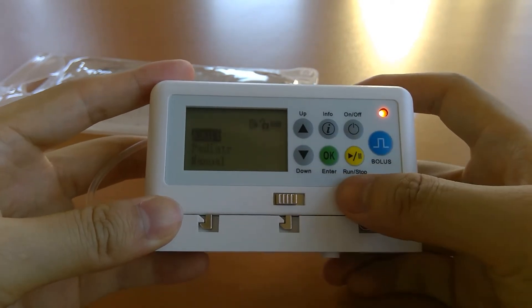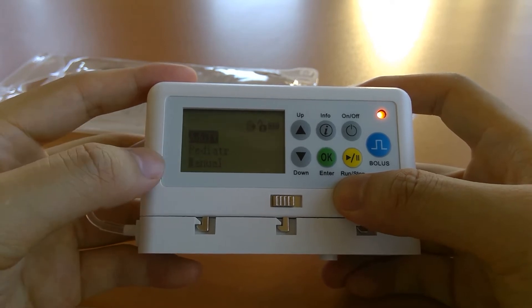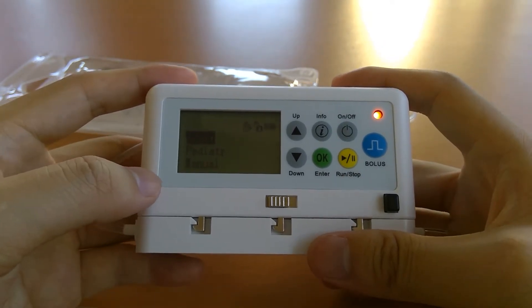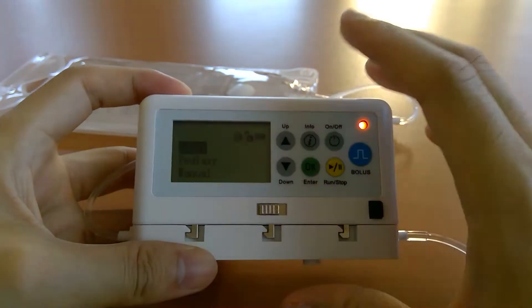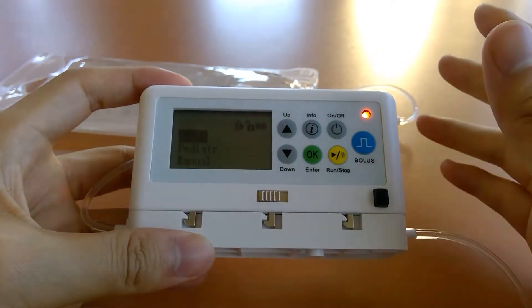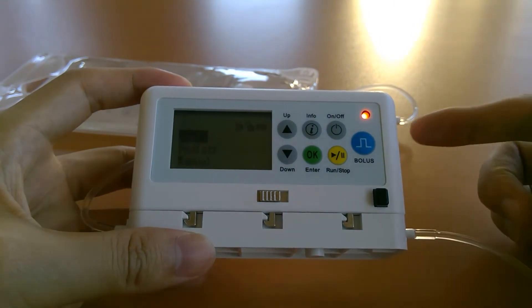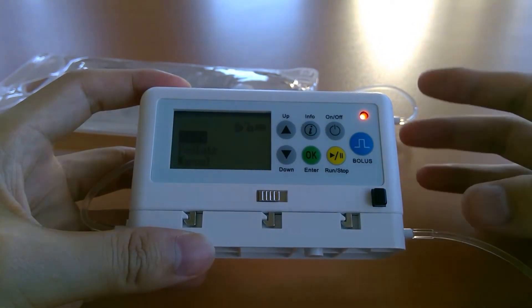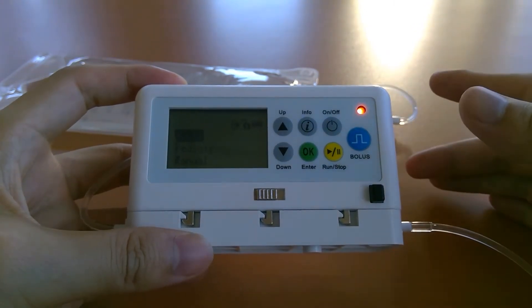From here you can access different folders of protocols. The pump can hold up to 12 custom protocols — there's no separate drug library on the pump; those 12 protocols serve as the drug library. So you can have 12 drugs, and when we upgrade in the near future to a larger memory chip, you'll be able to have 64 protocols or 64 drugs.